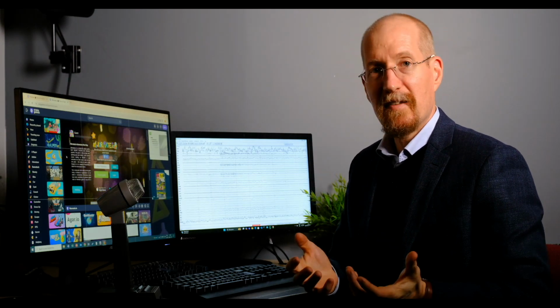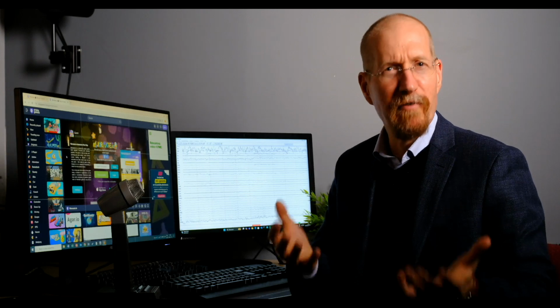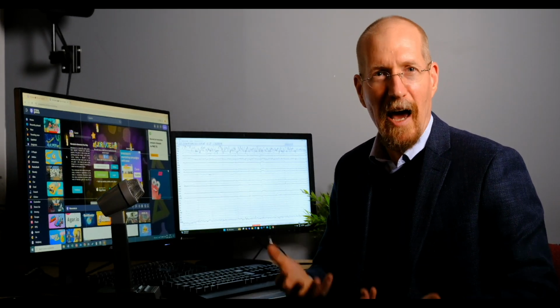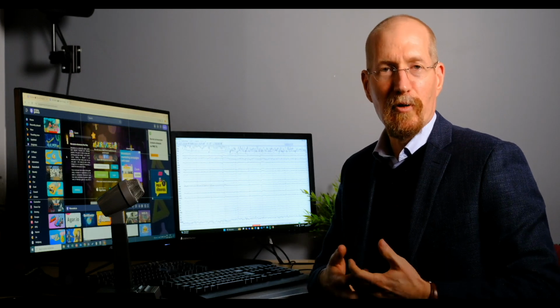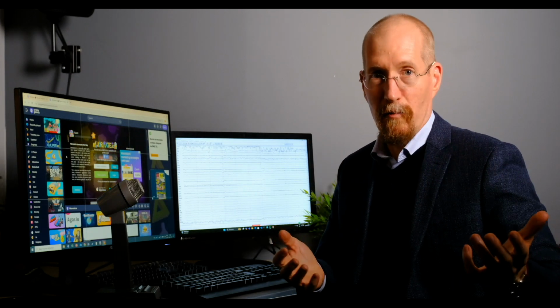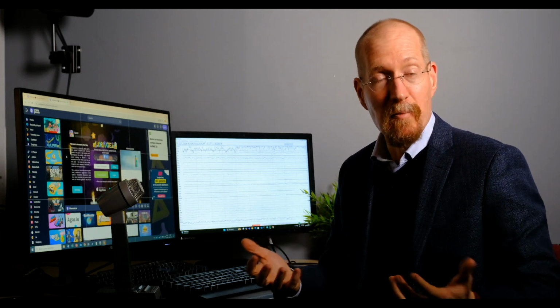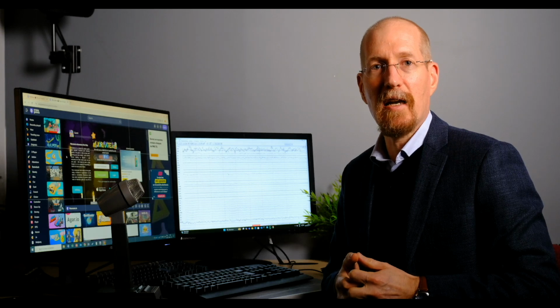Now, for today's tasks, we're going to try to do something fun for this video, but also in the spirit of doing something ecologically valid. So in human-computer interaction science, and often at what we do at the Tech3lab, we try to do tasks that are close to what people do in real life. So playing games is something that people do in real life, and using EEG to understand brain activity during a real-life task is something that is very important to the Tech3lab and something that we pride ourselves in being able to publish. So today we're going to run 2 games.